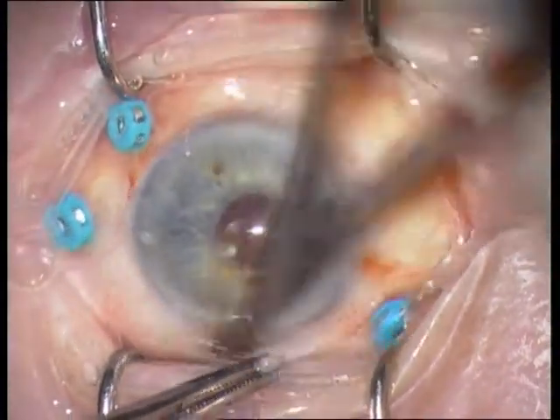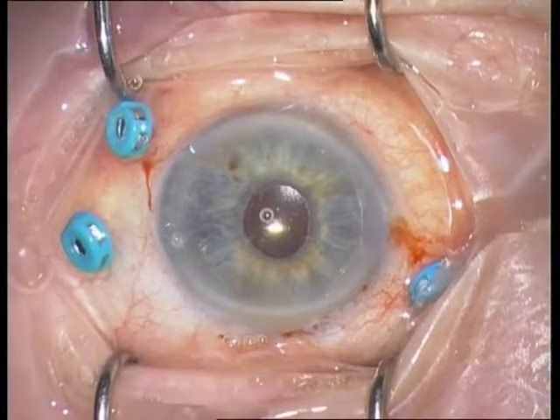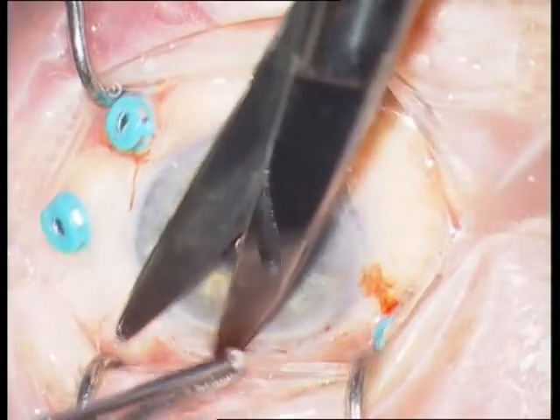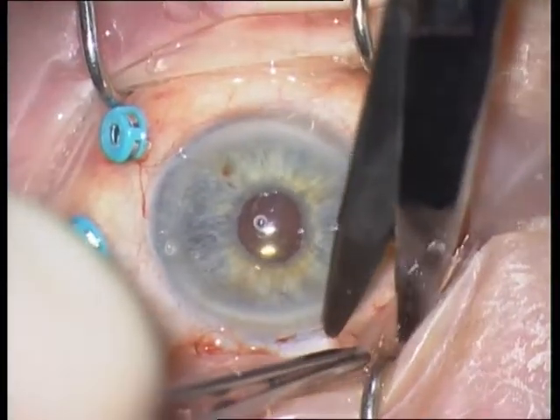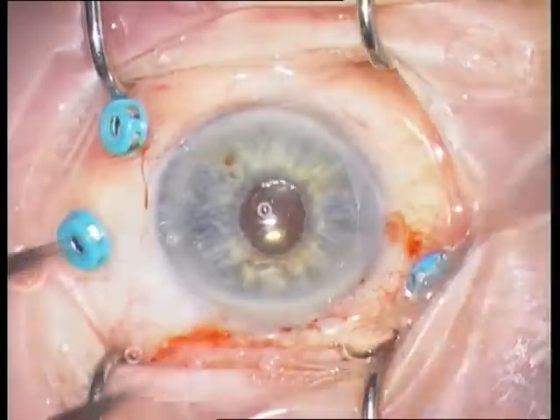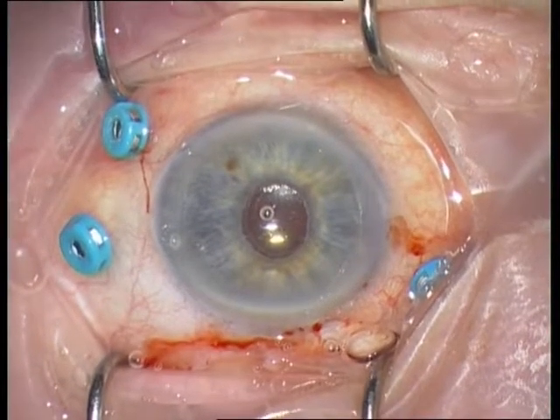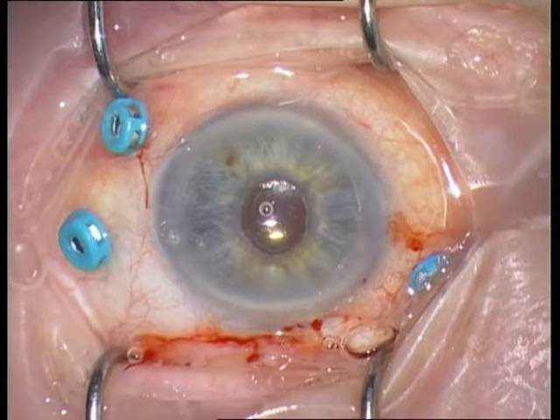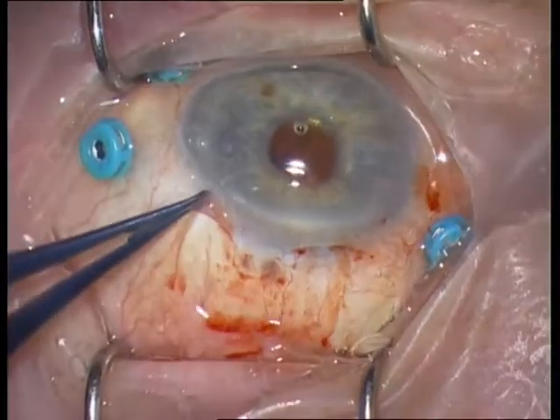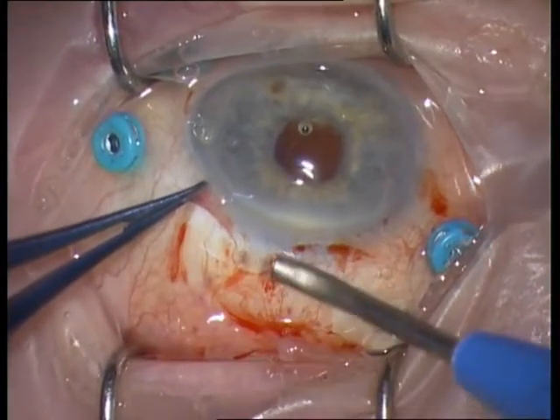Insert three 25-gauge trocars 3.5 mm behind the limbus and then perform a limbal peritomy at 12 o'clock. Dissect the conjunctival tissue with Tenon from the sclera. If necessary, cauterize the bleeding vessels.